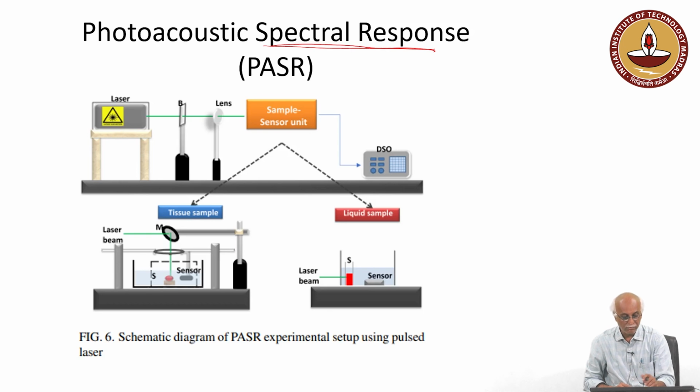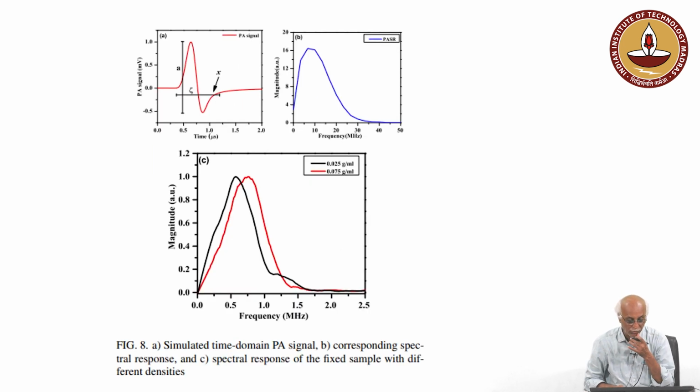Laser interacts with the tissue, and a sensor over here detects the acoustic signal which is generated. Now, this acoustic signal is captured with the help of a digital storage oscilloscope. It can be a solid tissue, or maybe a liquid sample, etc. These are experimental setups.